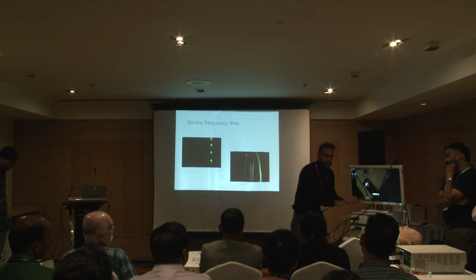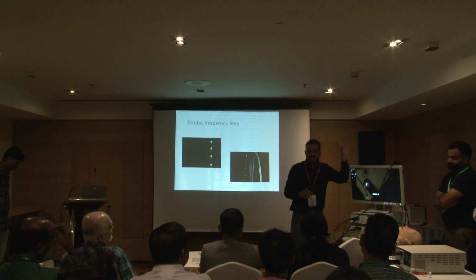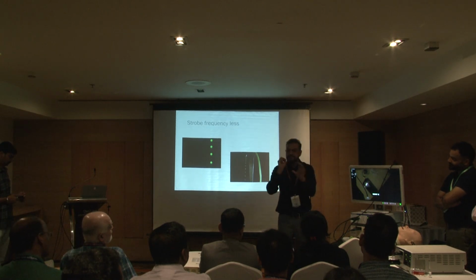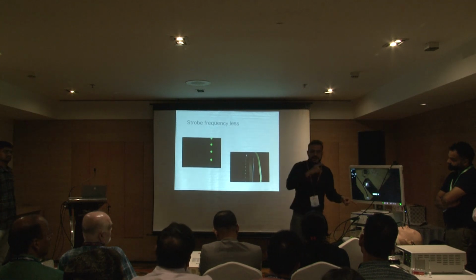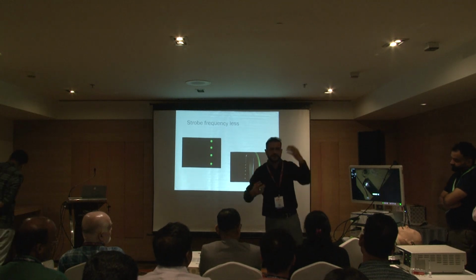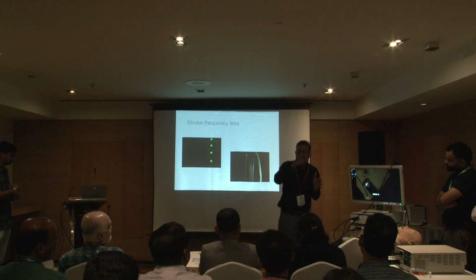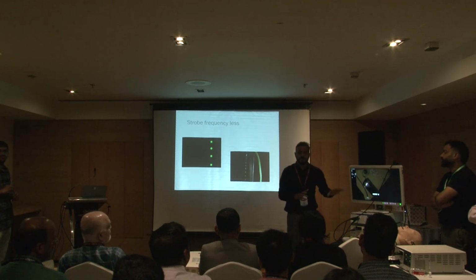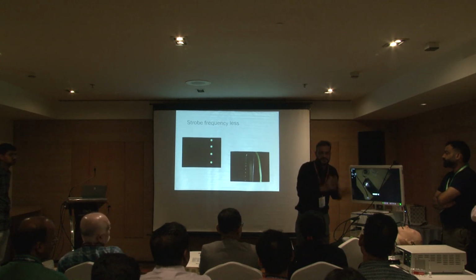Now it is the job of the strobe. So having a good strobe, from a good company. I am not supporting any company, but having a strobe of a good company matters, because this machine decides it. It has to give the strobe light slightly less than this F0. It will vary from person to person. 120 for me, 150 for him, 150 for somebody else. So this machine has to give the strobe light slightly lesser than this F0 frequency. That is why investing in a strobe from a good company is very, very important. There are many companies making it, just see whether this is being followed or not.